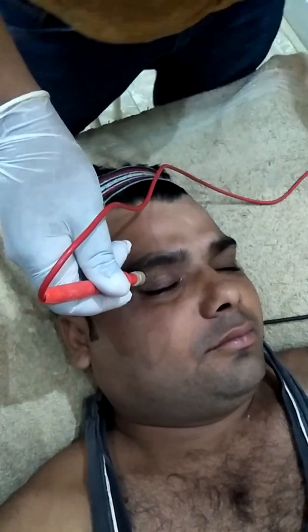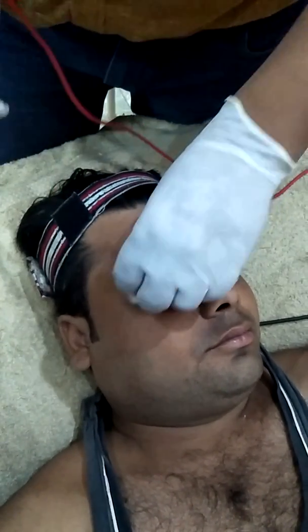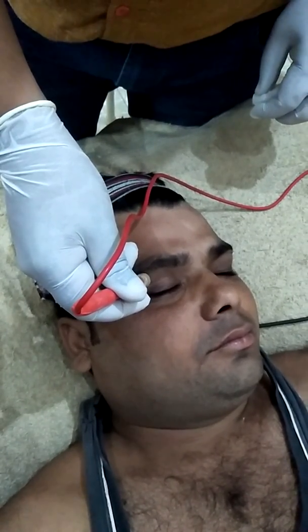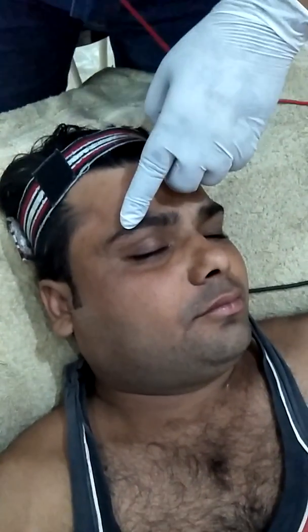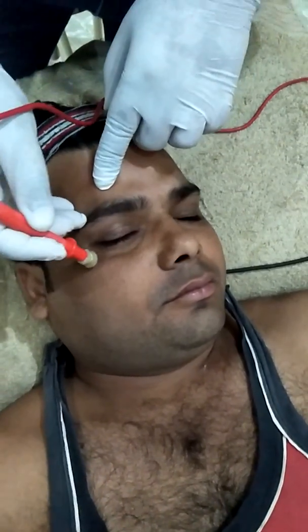You see the contraction of the blinking eyes. You should never keep the electrode for too long over the skin area. It may cause inflammation of the eyes.